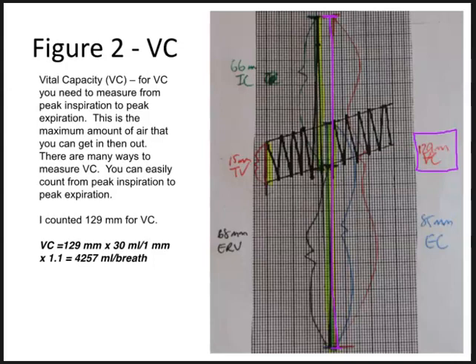So that's it for this discussion on respiratory physiology for this lab. Again, you'll need to be able to look at a tracing for rest versus exercise, and know that with exercise all variables will go up. So you need to be able to count the number of squares to get tidal volume, and then be able to get the respiratory rate. And then once you have tidal volume and respiratory rate, you'll be able to get minute ventilation, and also you can take a look at the tracing to get oxygen consumption.